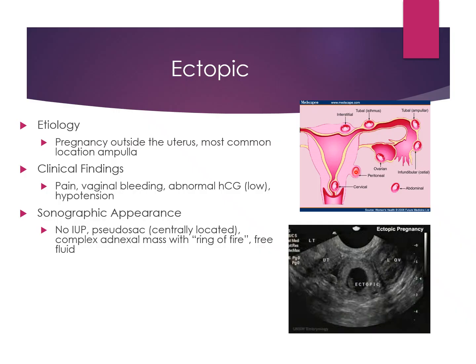So when I talk about ectopics, I'm going to talk about signs that demonstrate an ectopic, and then using your knowledge of anatomy to find out exactly where this is at, because it's not enough to say, oh, I found an ectopic somewhere on the left side. No, you really have to tell the radiologist: was it in the ovary? Was it in the fallopian tube? Is it in the uterus? So clinical findings for an ectopic are going to be a really low HCG.